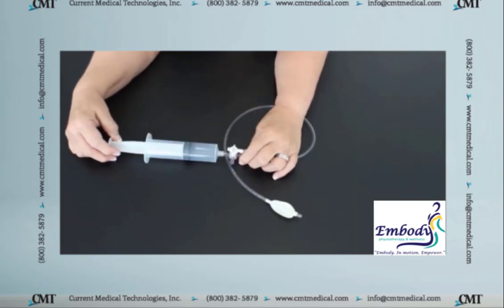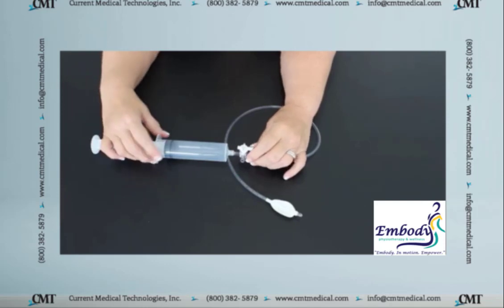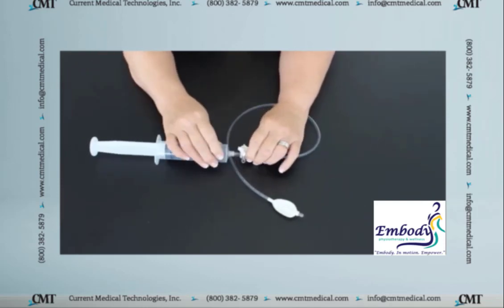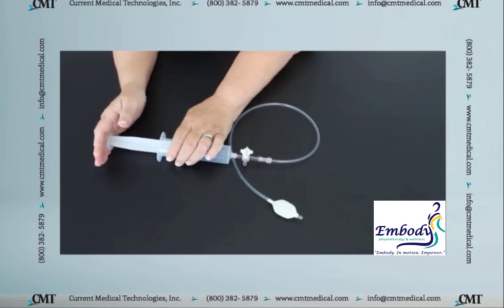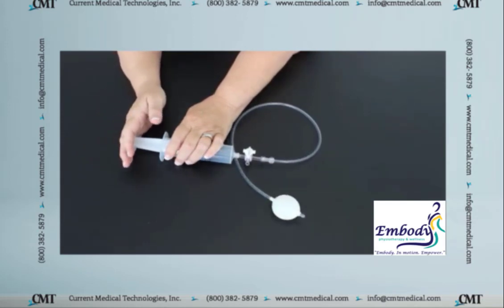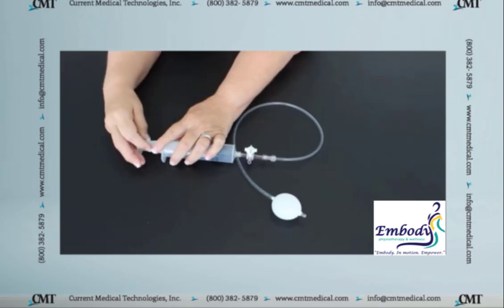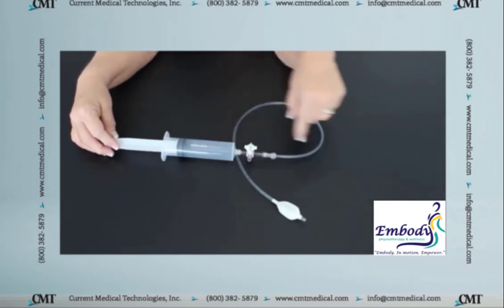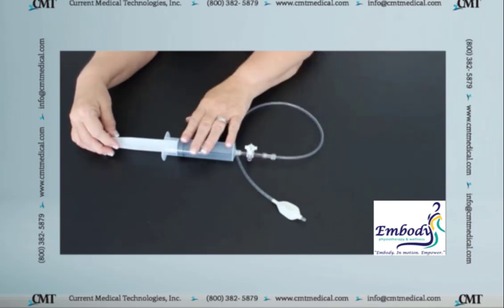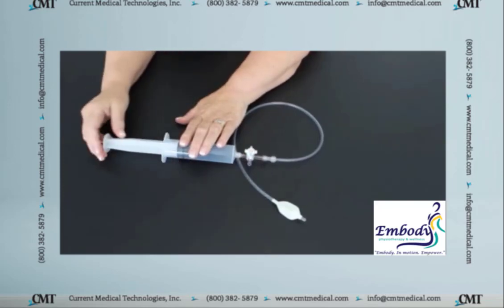In order to put air into the balloon, I'm going to keep the balloon locked and move the syringe back to 60 cc of air. Then I'm going to move the stopcock to the off position at port two. Now that means I'm going to be able to push air into the tube of the balloon, and you'll see the balloon filling up. I can also pull the air out of the balloon just as easily, because the switch is on port two, which allows air to flow easily back and forth from the syringe to the balloon.